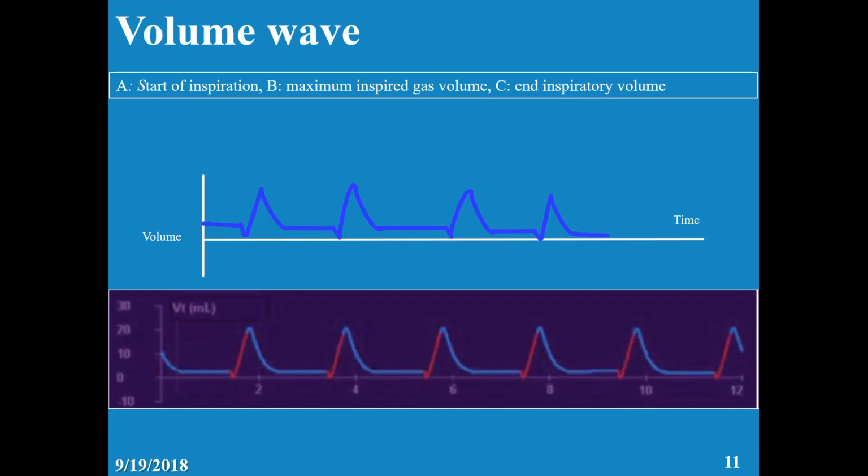So is it volume or pressure control? It's pressure because there is no plateau. Plateau where? There is no plateau. Correct. So mostly this is a pressure control because the volume is a peak. There is no sustain of the volume. Yeah, that's acceptable.